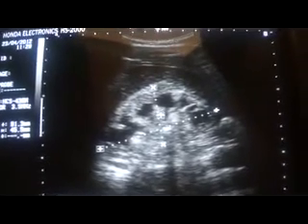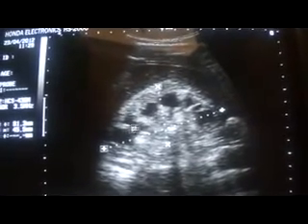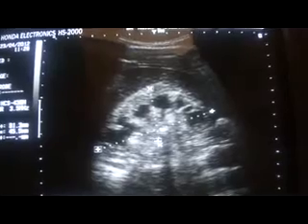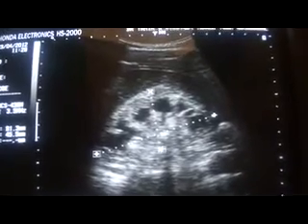Third thing to note is the brightness of the cortex. This is the cortex, and its brightness is increased significantly, though thickness is preserved, measures 6.9 at the mid region.